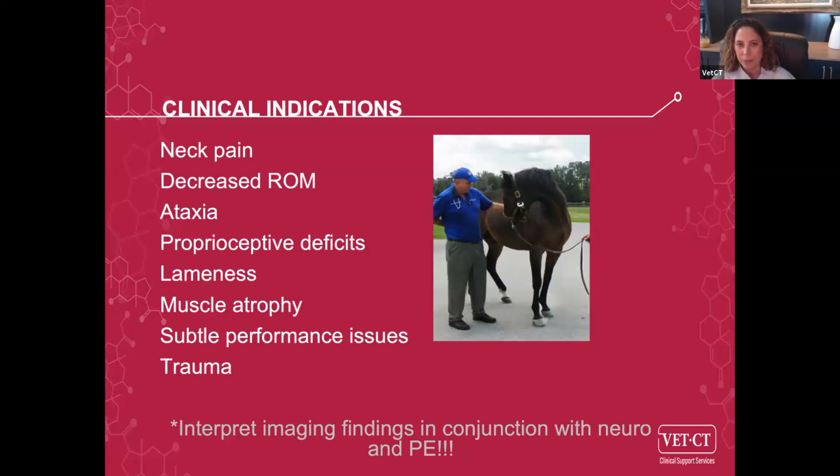It's just really important to keep in mind that anytime you have radiographic abnormalities in the neck, it's super, super imperative that these are interpreted in light of whatever clinical, physical exam and neuro exam findings you have, because they alone could be incidental or don't always mean an end-all be-all.